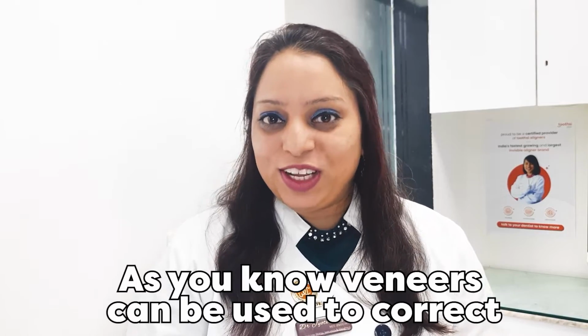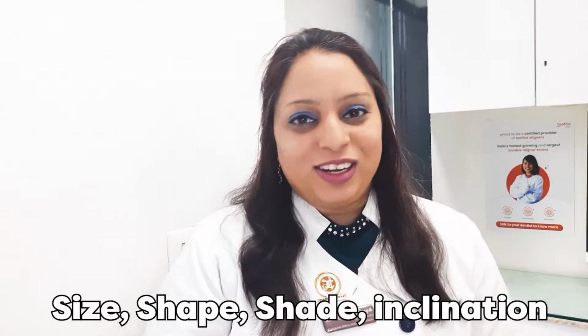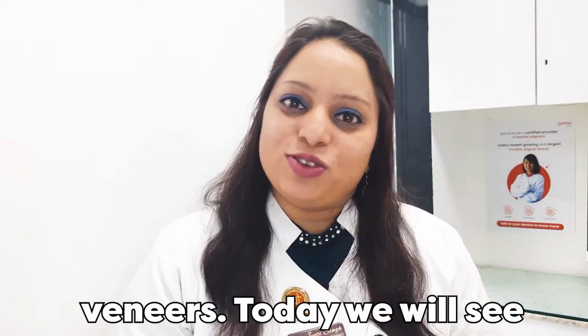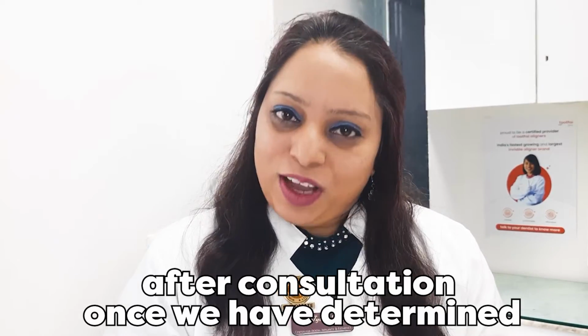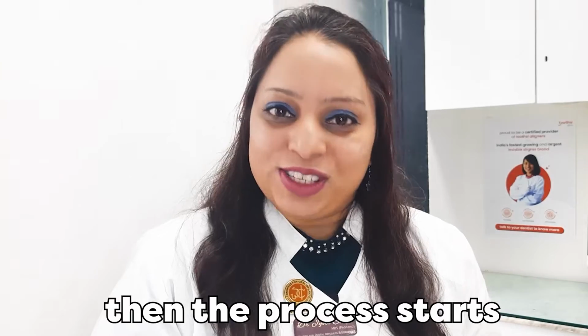As you know, veneers can be used to correct size, shape, shade, inclination, and even small gaps can be corrected. There are multiple steps in doing veneers, and today we'll see how these steps are done and why these are important. After consultation, once we have determined that veneers can actually improve your smile, then the process starts.